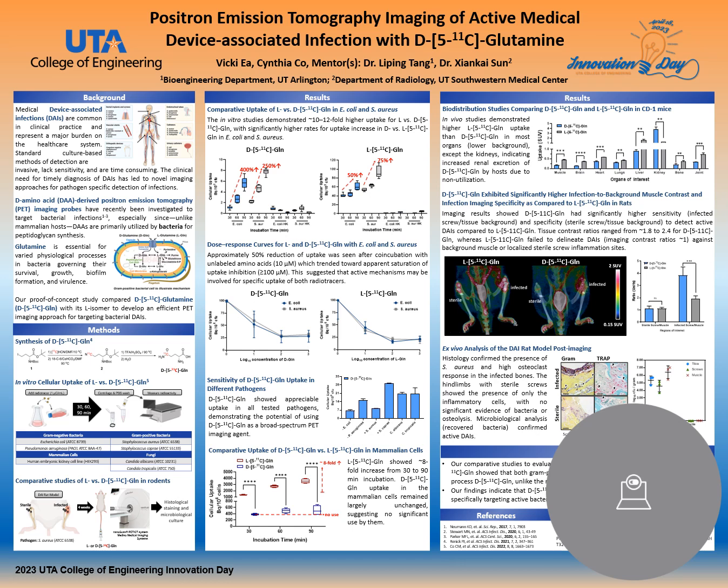In our study, we use PET imaging and a D-glutamine-based imaging probe to target and visualize bacterial infection in a rat model to evaluate its potential use in the clinic. Meanwhile, L-glutamine served as our control.